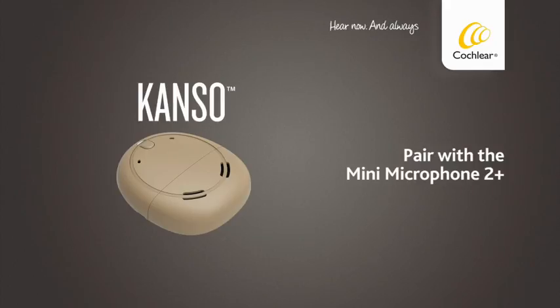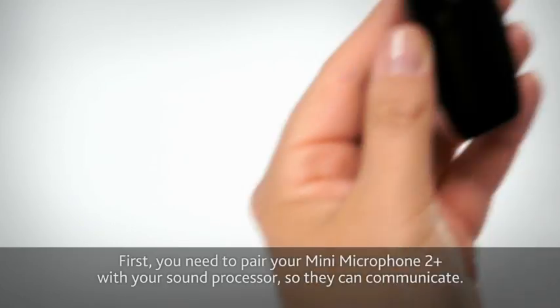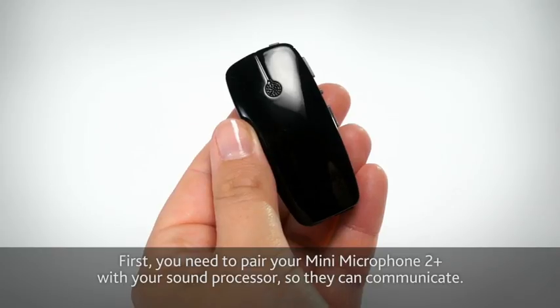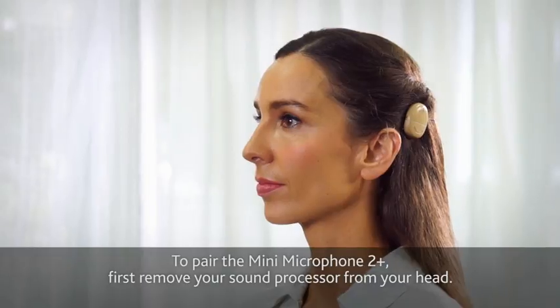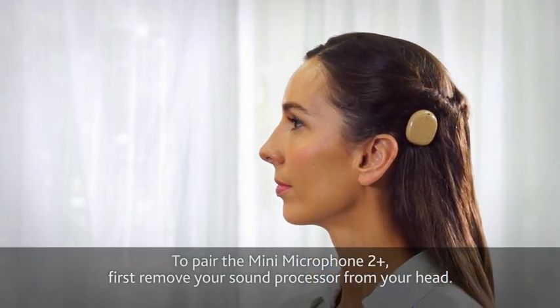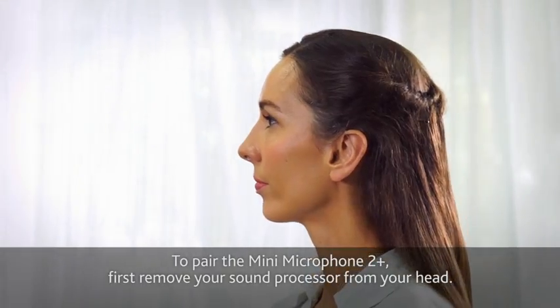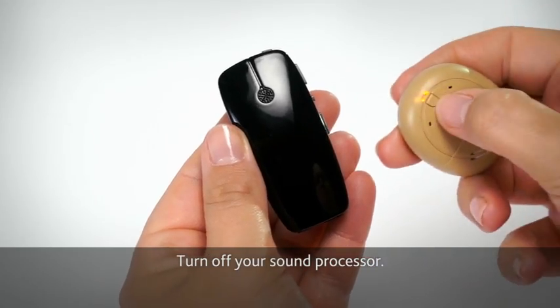Pair with the Mini Microphone 2 Plus. First, you need to pair your Mini Microphone 2 Plus with your sound processor so they can communicate. To pair the Mini Microphone 2 Plus, first remove your sound processor from your head. Turn off your sound processor.